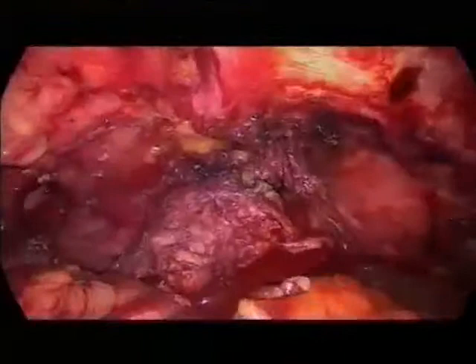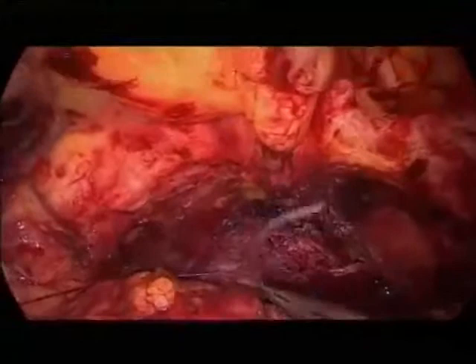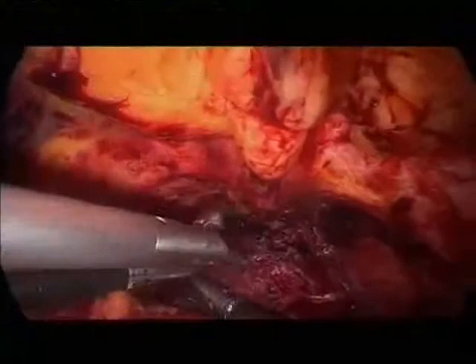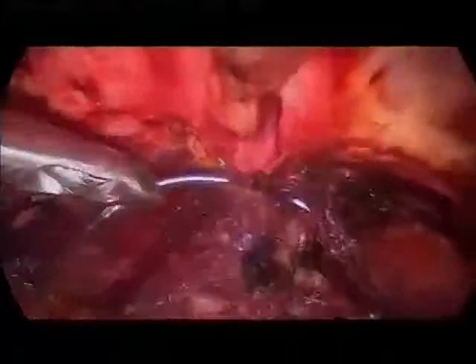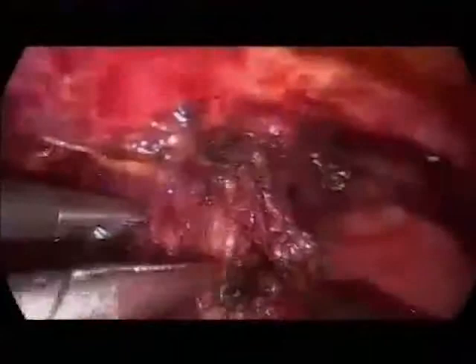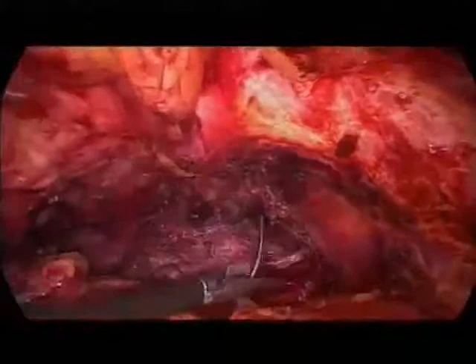So why are you not performing a stitch? Are you now doing the stitch? We do now the stitch. I like the stitch. We know it from Richard that you can cut the Santorini and suture later or increase the pressure, but I think it's relatively easy to place a stitch here, and you're really safe if you do it. It's nice to see here the apex. Go back a little bit. The end of the suture.